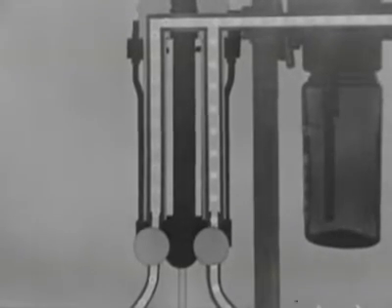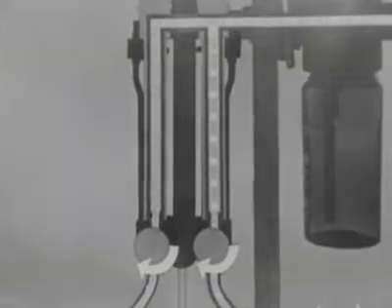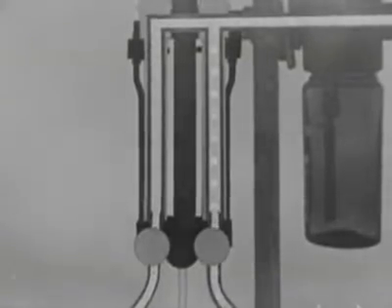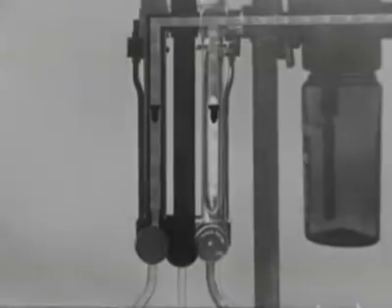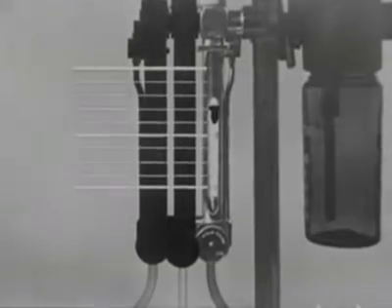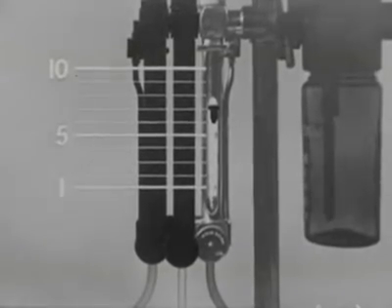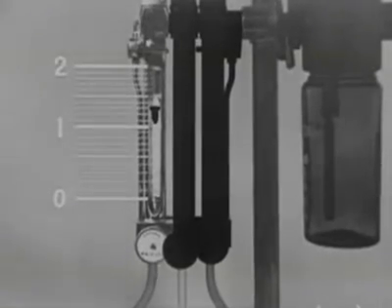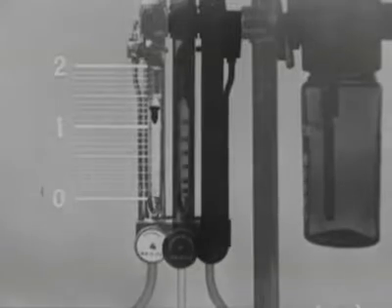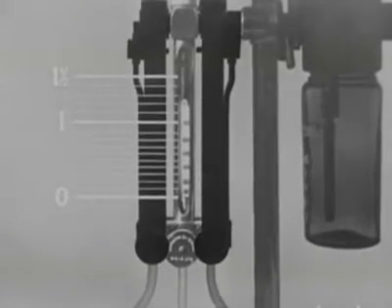The rate of flow is adjusted by thumb screws at the bottom of the flow meters. It is indicated by the height of a floating bobbin on a calibrated scale, the reading being taken from the top of the bobbin. The nitrous oxide scale is marked in liters to 10 liters per minute, the oxygen in cubic centimeters to 2 liters per minute, and the carbon dioxide in cubic centimeters to 1.5 liters a minute.